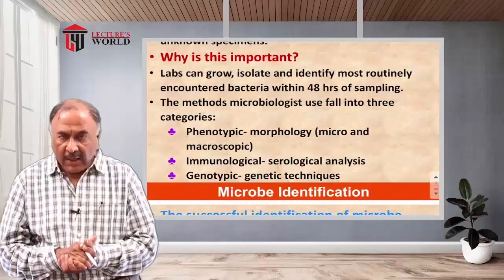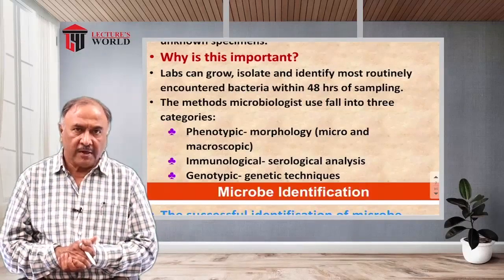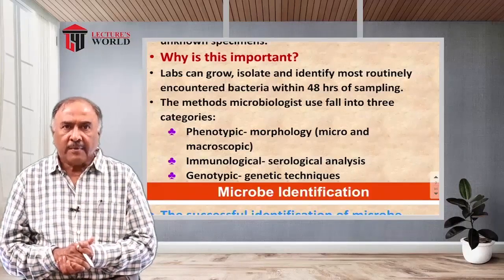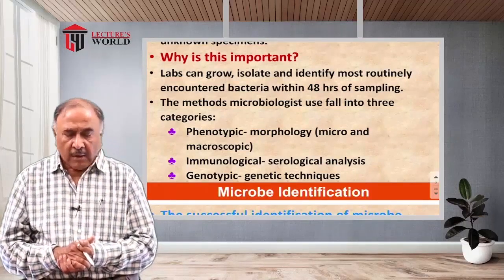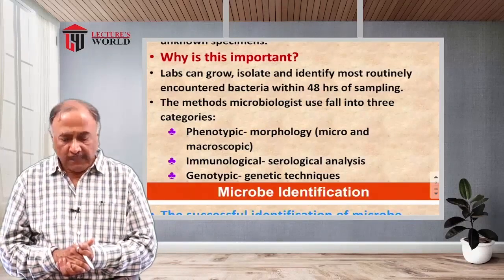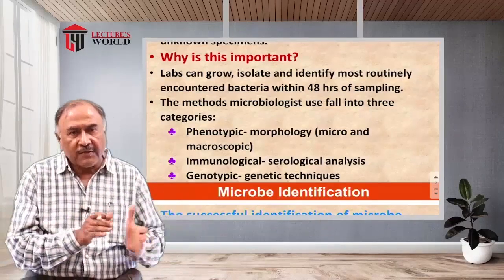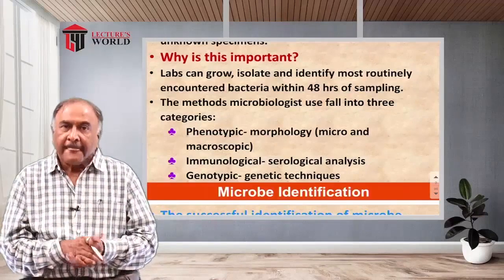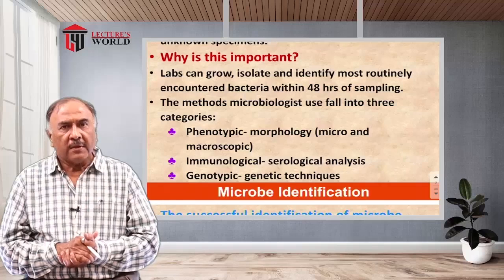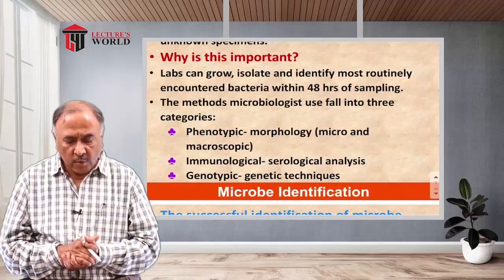Now, as I have told you, the importance of identification in clinical microbiology, what is being done usually is we collect the sample, grow them, try to isolate the responsible causative agent, and then identify it. This normally takes 48 to 72 hours.